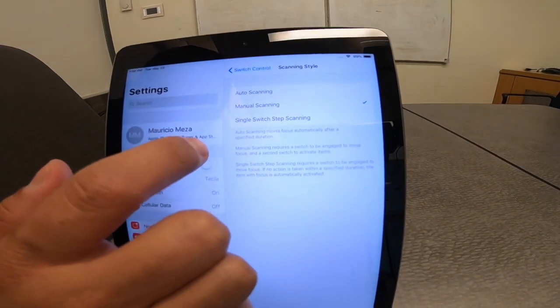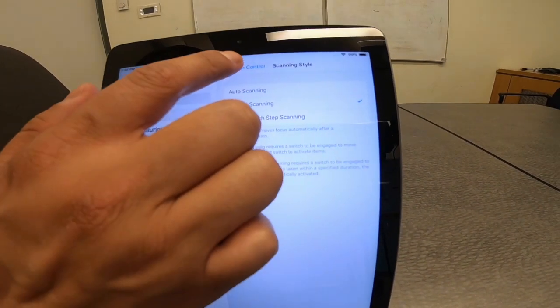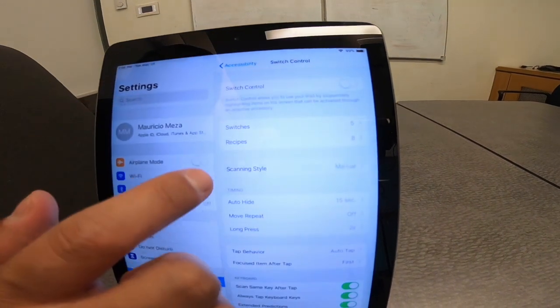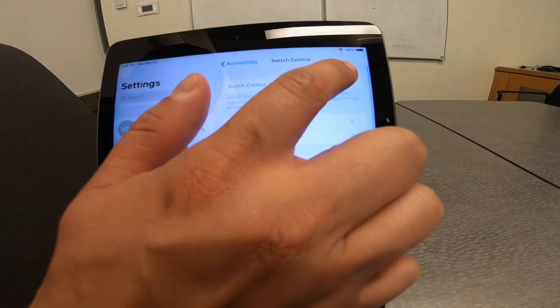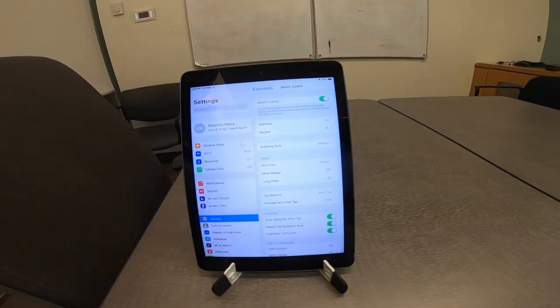Great job, Tecla Insider. Now, all you have to do is turn your switch control on and you will be able to control your device.